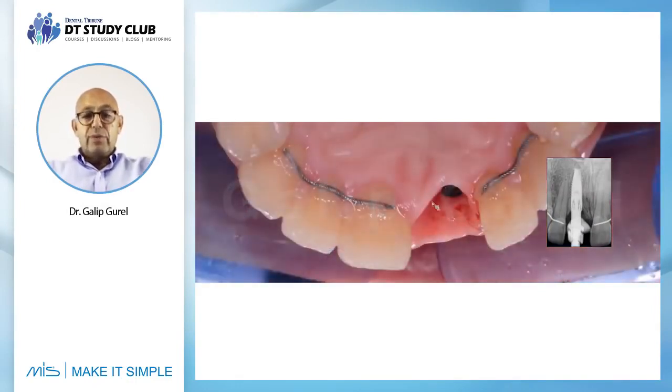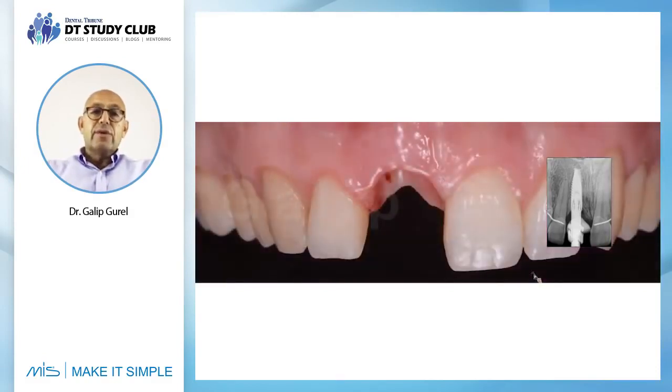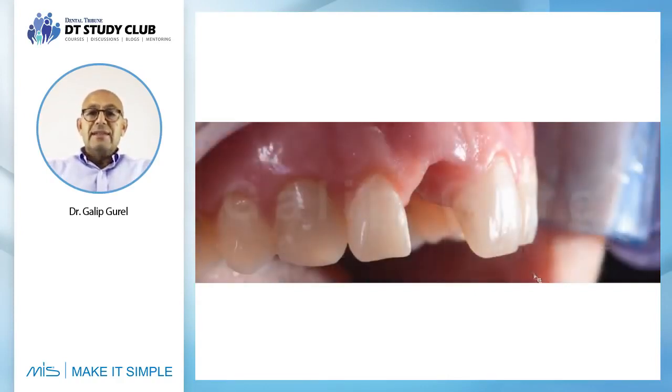Again, we provided that with the composites we added, subtracted, and shaped throughout the journey. From inside, outside, wherever you want, look at this. I think this is a very successful socket formation. And then what we have to do here is go to the lab stage.